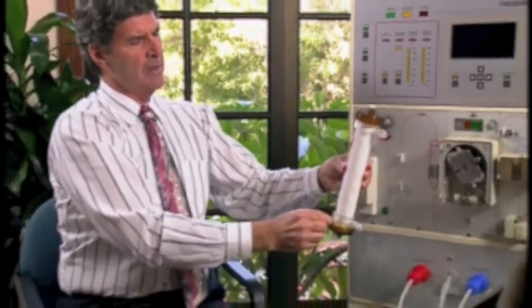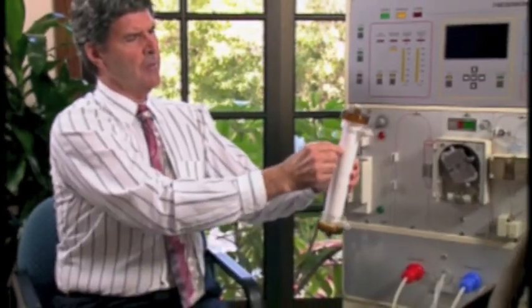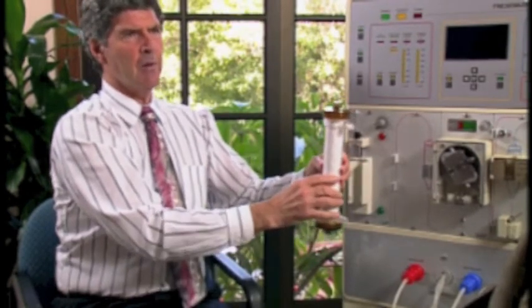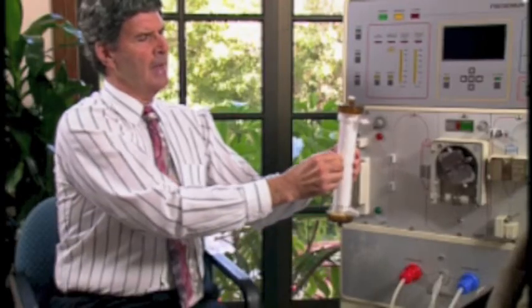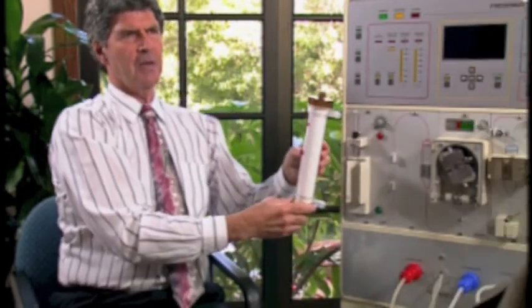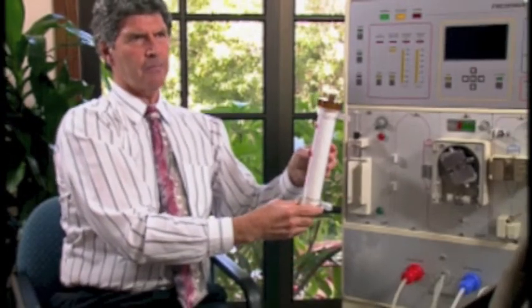We have a pump. The pump pumps the blood from the patient's arm. The blood goes through these hollow fibers. At the same time, we pump dialysate fluid, which represents our normal plasma with the electrolyte content. And that then acts to pull molecules such as potassium and get rid of the waste products.